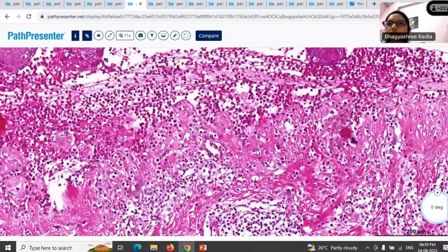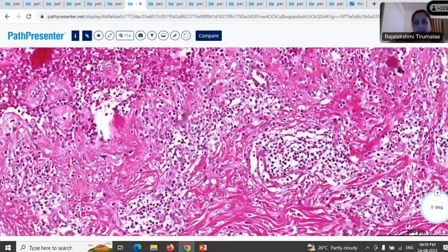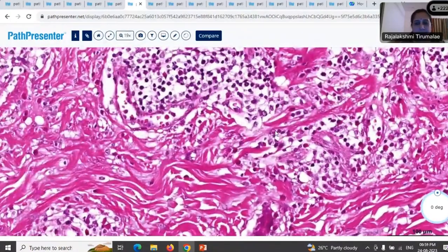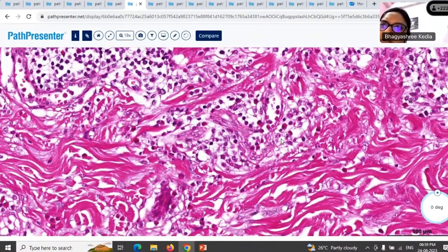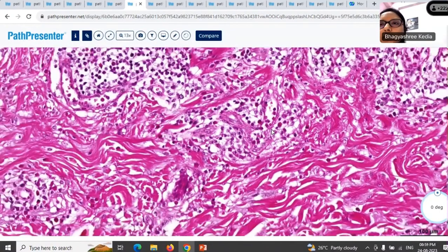Okay. And what about the dermal infiltrate? What cells are here? Ma'am, predominantly they are mixed. You see lymphocytes here also, right? Yes, ma'am. They are mixed. But the most interesting finding in this case is not in the blister. I always like to go and look at the side of the blister.